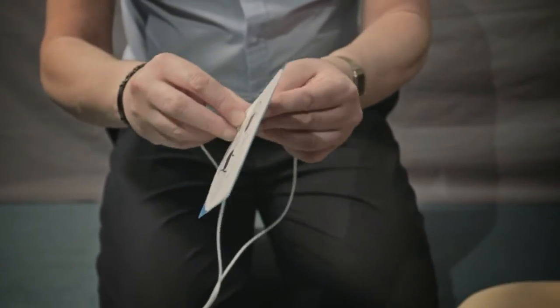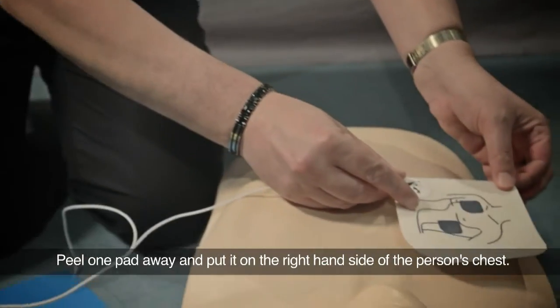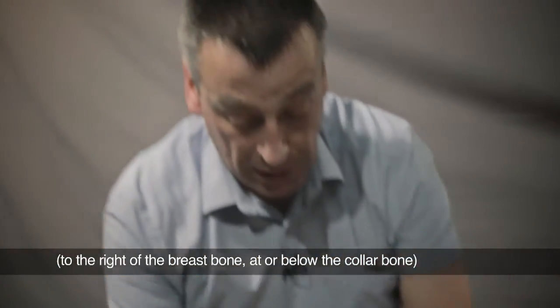The two pads will either be back to back like this, or they'll be on two separate pads. All you do is peel one pad away and put it on the right hand side of the person's chest — that's to the right of the breastbone, at or below the collarbone — and push it down firmly.